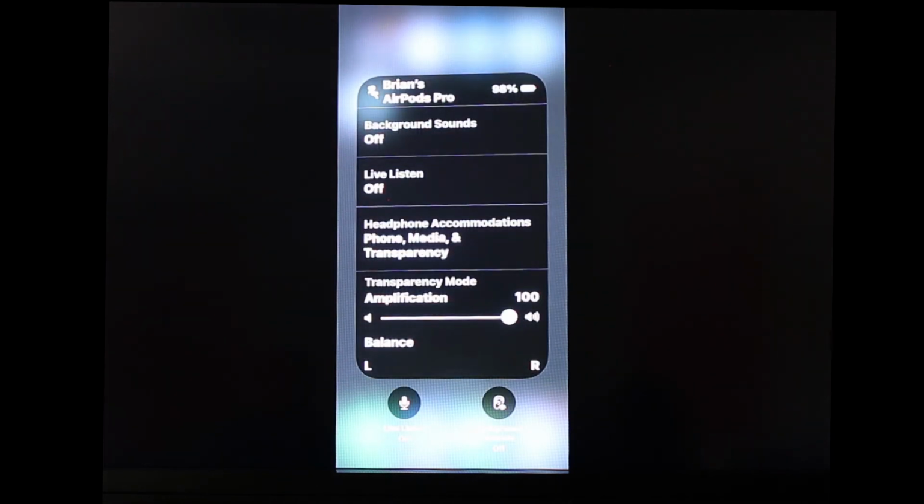So a couple of different features. Again, that's Live Listen. And Live Listen is a great feature for all sorts of needs: focus and attention, hard of hearing, other types of things for folks. Well, that's your tech tip for today.